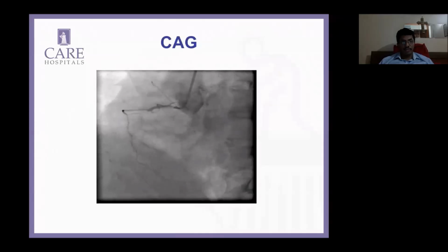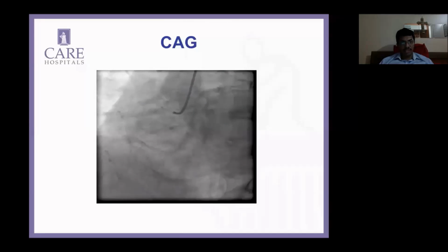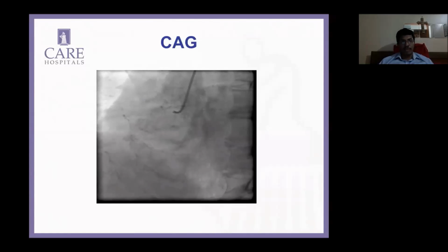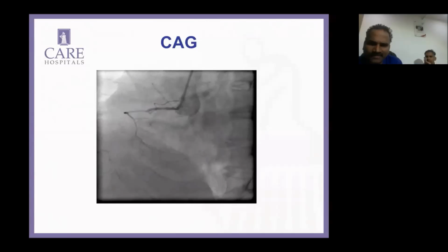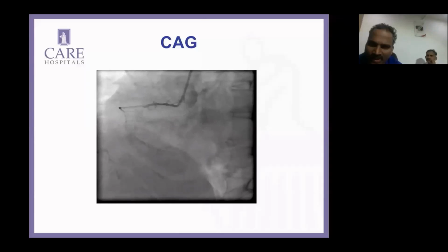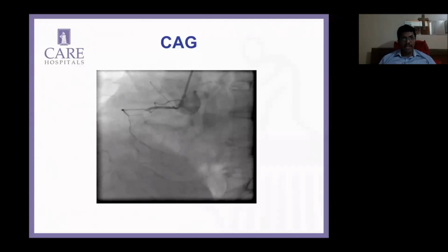And this is the angio. Coronary angiogram was done based on the clinical scenario, and you can see here there is a proximal total occlusion of the RCA. I haven't shown it, but the left system is completely normal. Is there any collateralization from the left system, sir? No collateralization. So the distal RCA is not visible at all. PDA, PLVB not visible at all. The patient again had some atypical symptoms. He neither has angina nor anything. Left system completely normal.